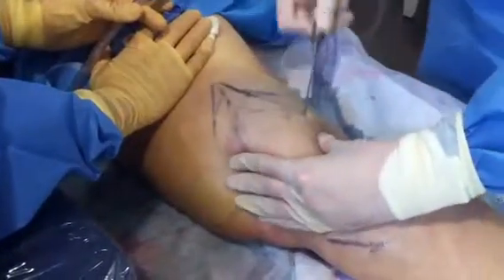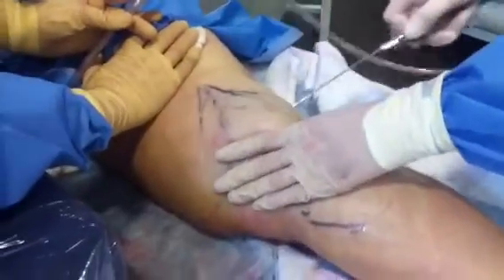This will probably continue on for the next several minutes, but that gives you a little bit of a preview of what knee liposuction looks like here at Art of Skin MD. So check us out on the web.